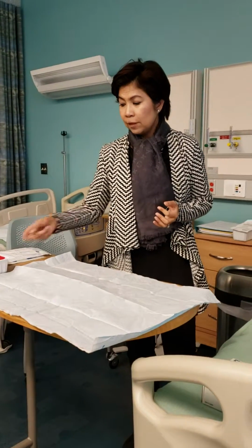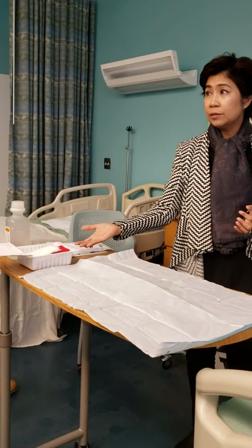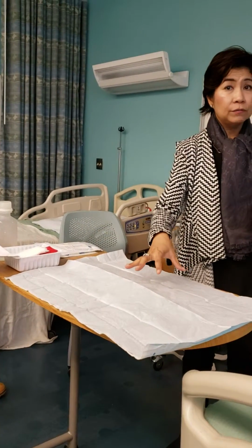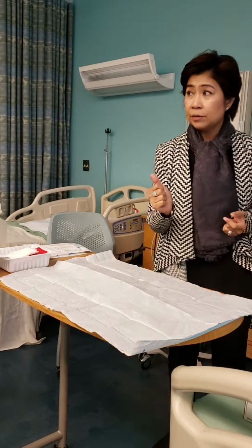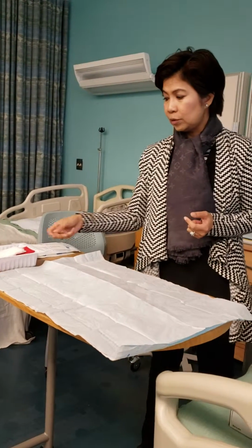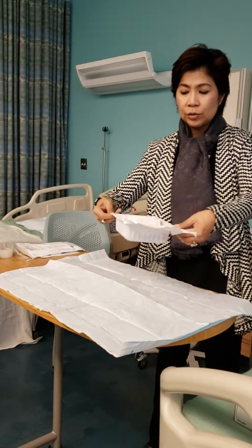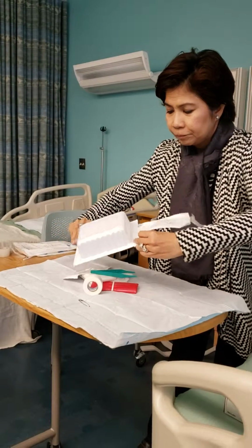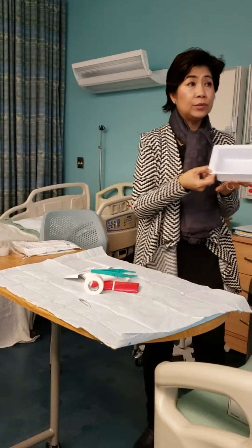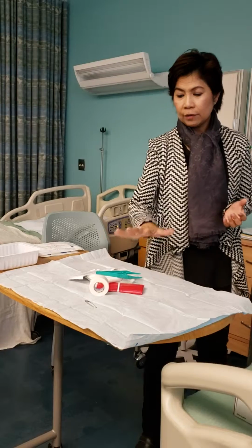And you cannot rest it here because the bottom is not sterile. Anything you drop in your sterile field needs to be touched by sterile gloves. Okay, sterile to sterile. Now, if I touch this, this is the border. What I can do is just drop everything there. So I can use this tray, and I'll tell you why. So I have everything there.